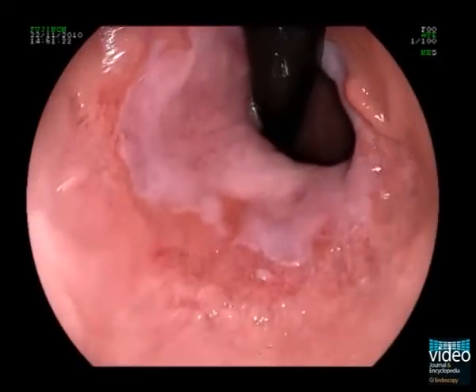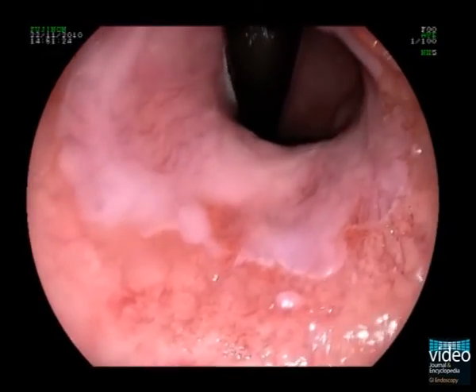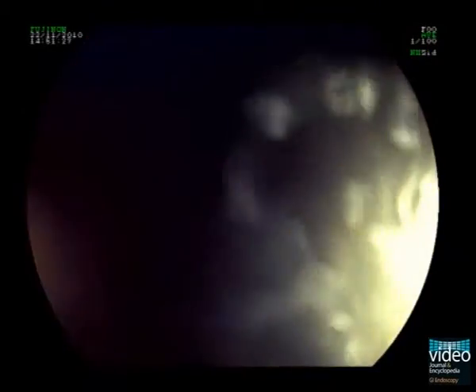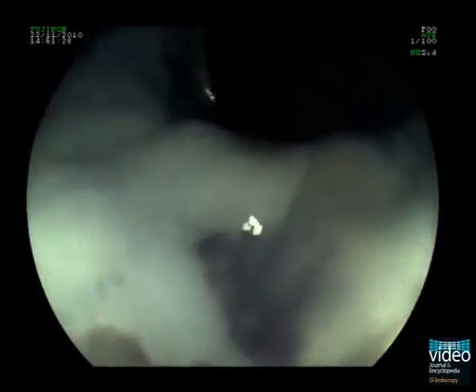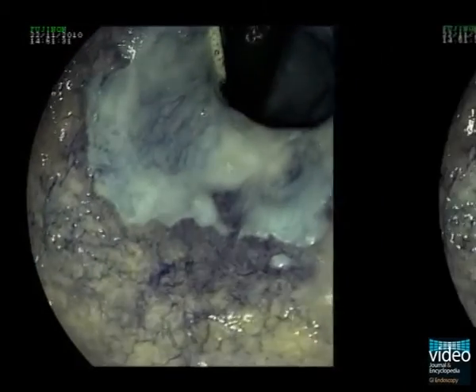However, it is clearly visible in the retroflex position, now at the 6 o'clock position. In the FICE mode, a suspicious area with more intense vascularization is seen.